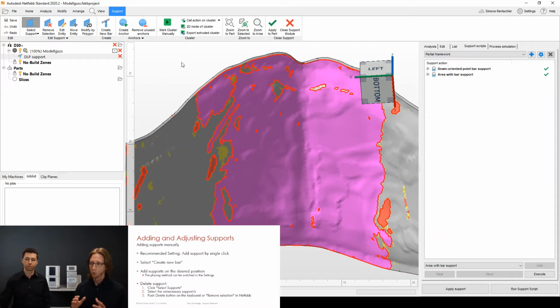If you are not sure that you have removed all the entities and anchors you might have added to the part, you can just perform a right mouse click somewhere in the picture, and as you can see, another context menu pops up, and there it would be remove all anchors and entities. And this way you can make sure that there's not an anchor and not a support in there. So what I mentioned earlier was we have to change the default settings. So the default setting is to perform a double click to add a support.